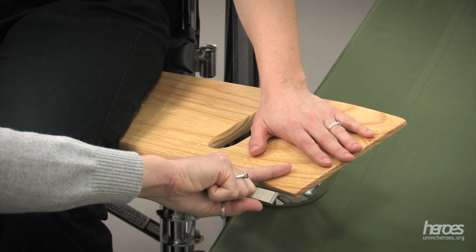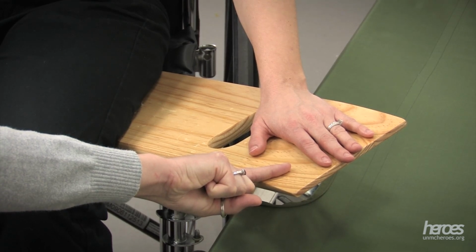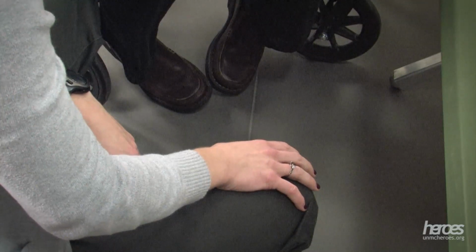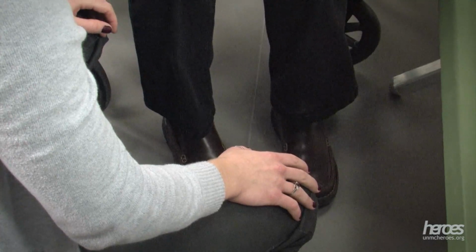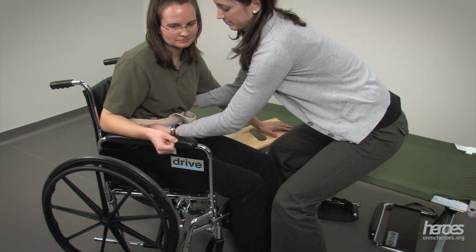Ask the individual to place their hand that is closest to the cot onto the far side of the slide board. Make sure they do not curl their fingers around the slide board because the fingers can get injured during the move from the wheelchair to the cot. Then position the individual's feet flat on the floor in front of the wheelchair and position yourself slightly in front and near the side of the individual with both your hands on the gait belt with an underhand grip.